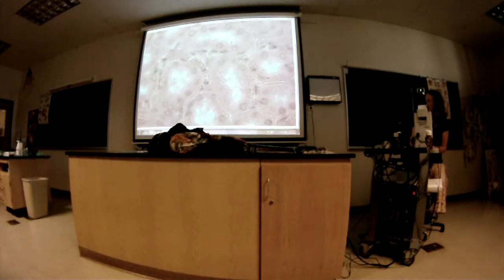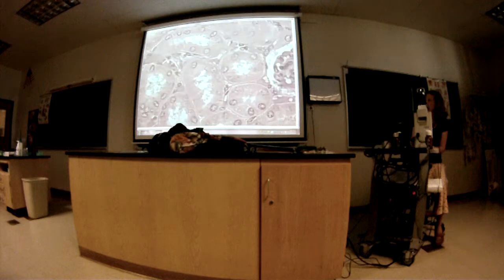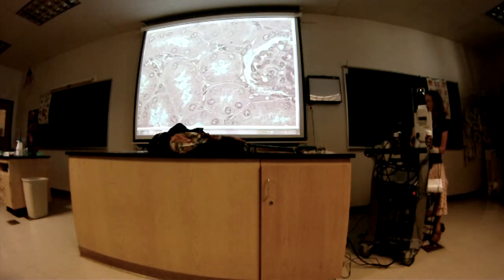And so we've got some other tubular structures here. What might this be? A convoluted tubule. You could put distal or proximal convoluted tubule, or I'll just say convoluted tubule. It could be either. You don't have to identify. One has a bigger lumen than the other, as you can see here, so you could distinguish if you wanted in the future.